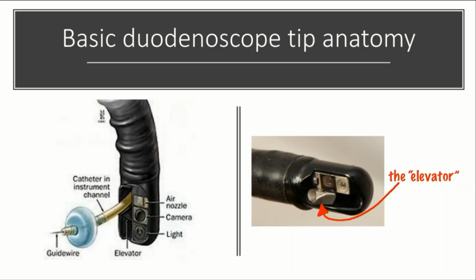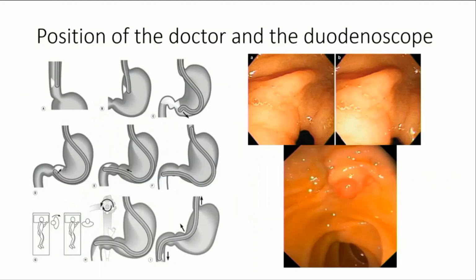You don't look straight ahead, but you are looking down on the floor and trying to move on by looking down on the floor. So this is the same analogy. And the second is this magic instrument, the elevator, that has the ability to elevate up the various instruments that we are using. So these are the two major differences.